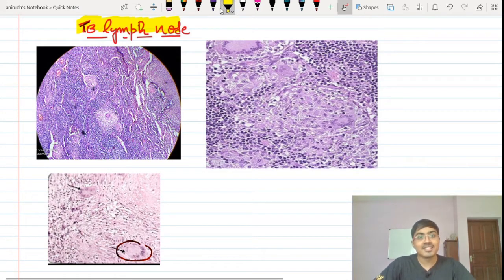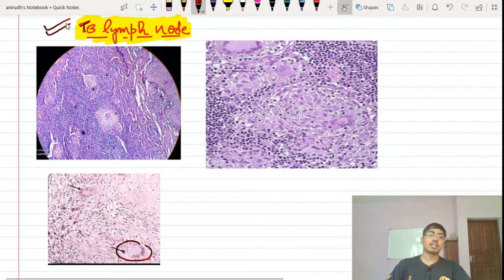Hello friends, in this last video we will look into the remaining few slides, and the first one that I am going to take is TB lymph node. In my opinion, this is a very vast topic where you can get questions from the very basic immunopathogenesis of tuberculosis. And remember, first of all, the primary foci of tuberculosis is most commonly inside the lung, isn't it?